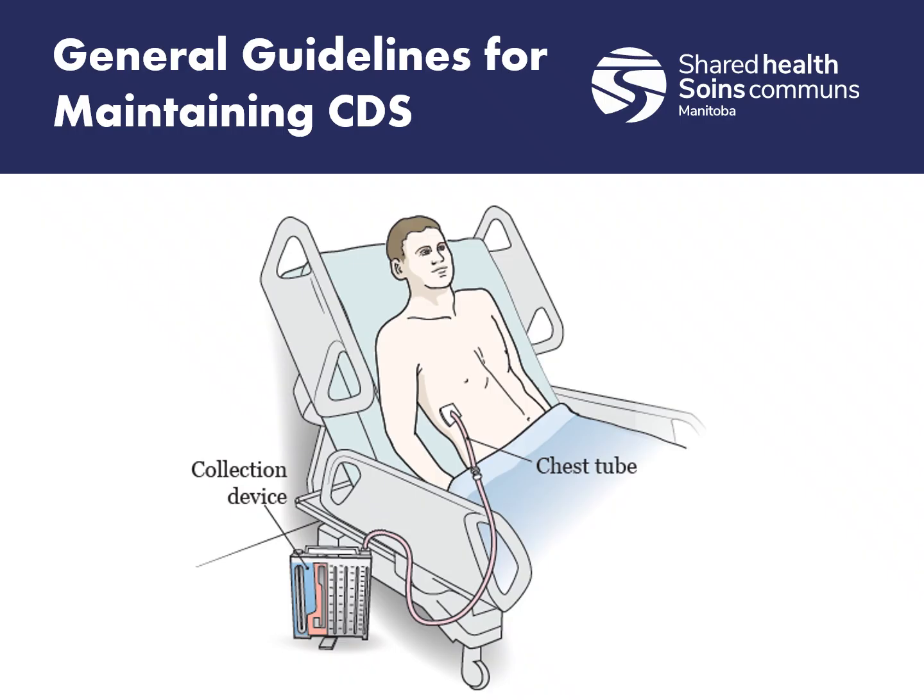If we are transporting as well, you can tell your patients to notify you immediately if they start developing any difficulty breathing, tightness in their chest, sudden chest pain, or if you notice on your vitals that they start having a drop in SpO2, or if they start developing rapid shallow breathing. Those are all indicators that something may be wrong with your patient.